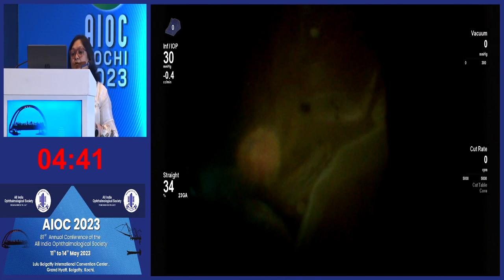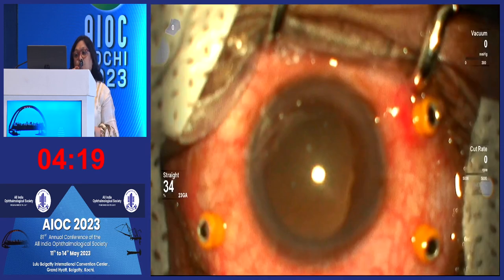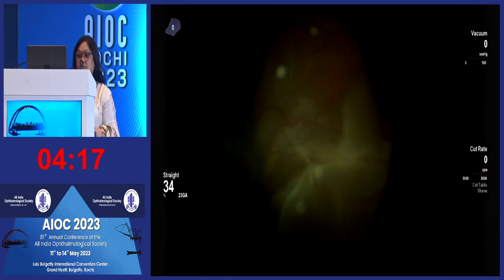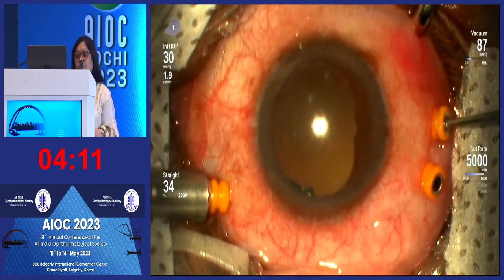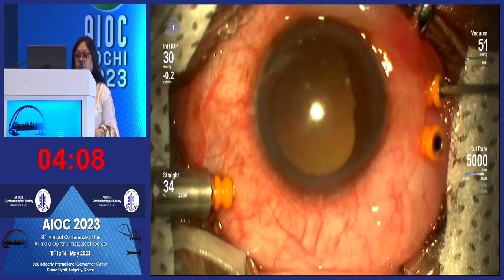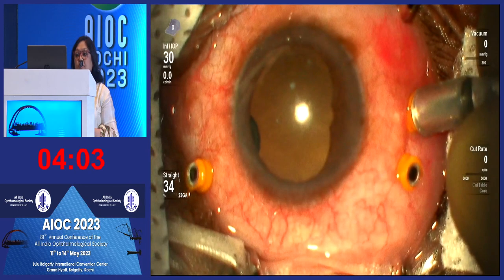So this is a 45-year-old gentleman who had come to us with a giant retinal tear, a phakic patient with a clear lens, who didn't want to touch the lens. There was a choroidal detachment associated, so we went ahead to do the surgery. You see the large GRT, and all the ports are made, but the infusion port is draining some choroidal fluid, and you can see that I'm nudging and I'm not able to go inside, so I changed the port position. I tried to put in a cutter which I know is going through, but every time my cannula would go into the subretinal space.